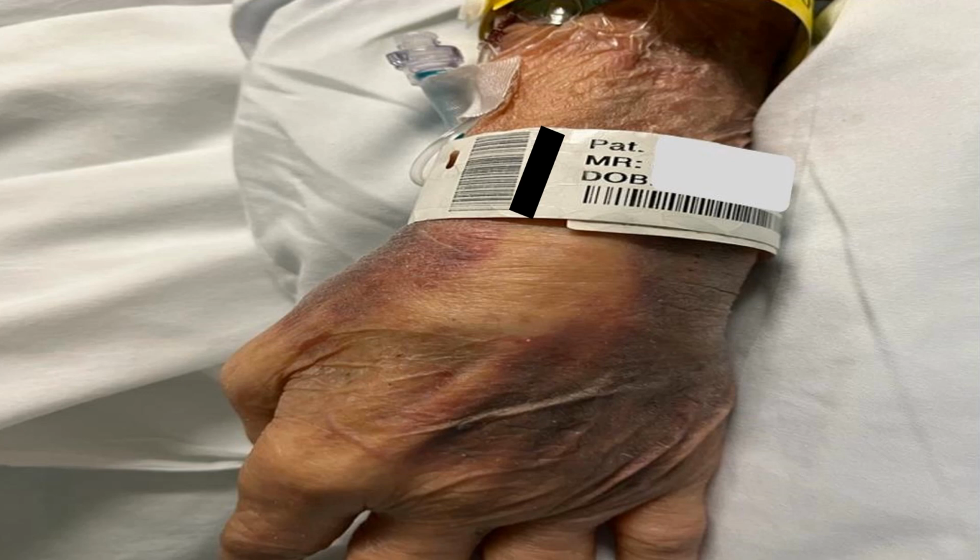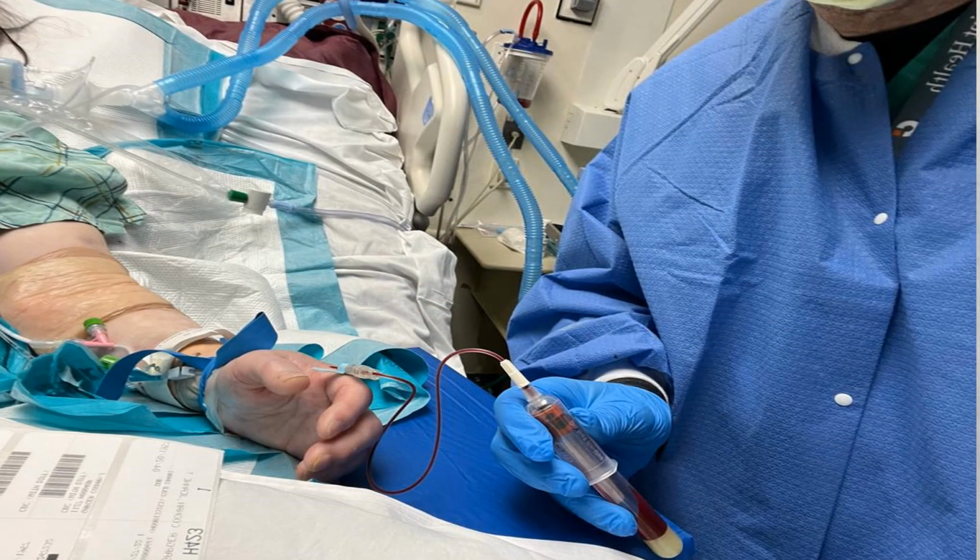So if the doctor or the nurse or the phlebotomist is not well trained and following protocols, they will be part of these pre-examination errors. Because once again, it is not just about taking the blood, it's about following protocol. So, si el flebotomista, el doctor, no está entrenado en cómo eliminar o reducir los errores preanalíticos en un paciente con edema o edematoso, este paciente va a tener problemas. Y esas son las cosas que nosotros debemos eliminar o reducir. These are the things that we have to eliminate or reduce. By what? By following protocols.